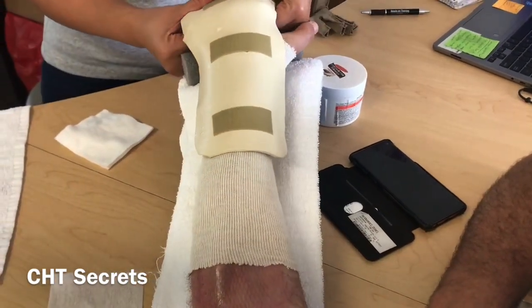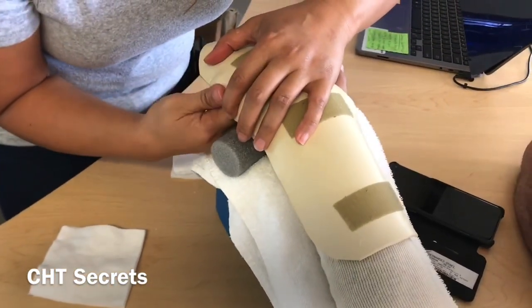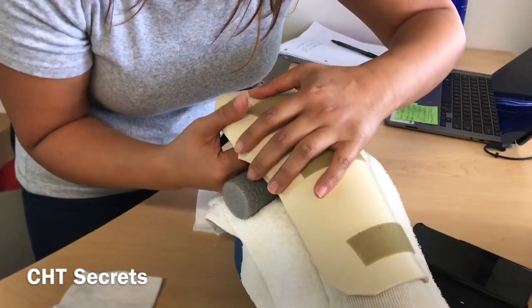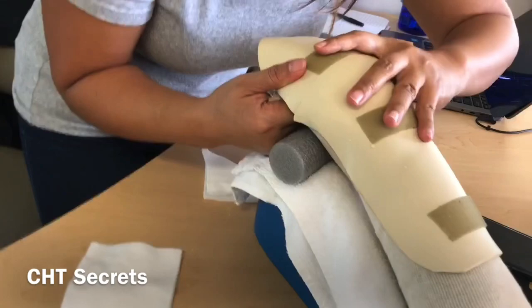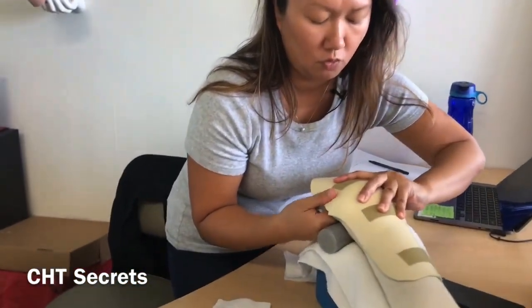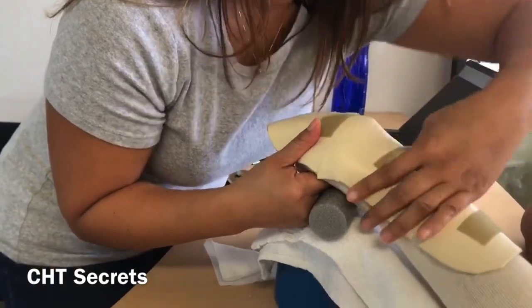Put the fingers next — and it's the small finger I want to focus on. If I'm focused on the small finger, I want to make sure that I have really good control over that small finger. And that's where I also need to put my strap.